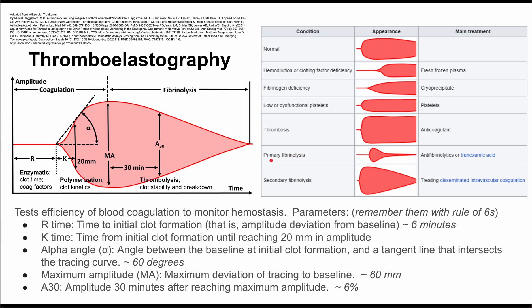If you have primary fibrinolysis, you might expect your curve to look like this, and you want to administer antifibrinolytics or tranexamic acid. If you have secondary fibrinolysis, your curve might look like this, and you want to treat the underlying problem — it might be disseminated intravascular coagulation, or DIC.